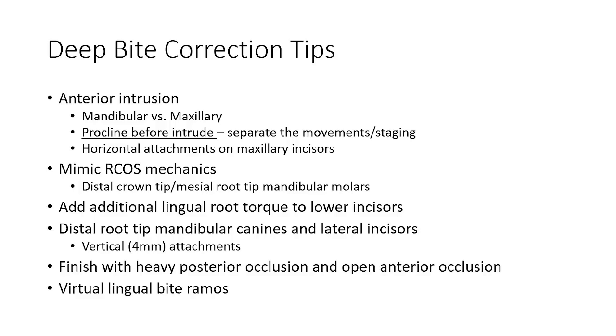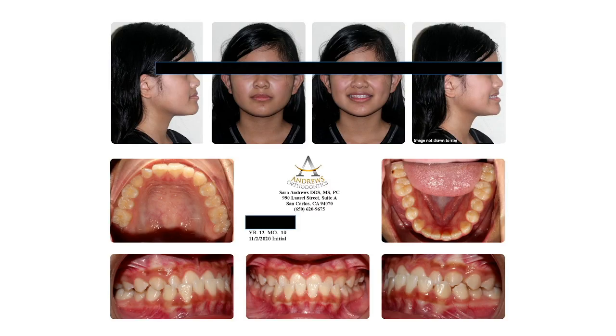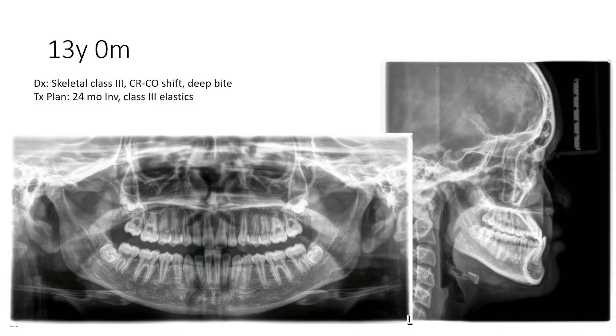And we went over all of these already. So this is a 12, 13-year-old. This is another very typical class 3 case. Invisalign works beautifully for class 3 cases, just to let you know. With the right ClinCheck, she's clearly a skeletal class 3. But what we have going for us here is if you look at her upper incisors, they're pretty upright. They're tipped back. So what does that tell us? We can afford to push them out. We can afford to procline the upper incisors.